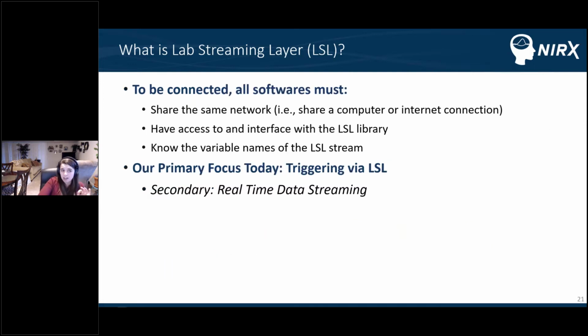It's really taken off in the last couple of years because of how easy it is to use. There are a couple of stipulations with LSL. To be connected, all software must share the same network. That could be the same internet connection, or it could also just be the same computer. All software must have access to and interface with the LSL library.